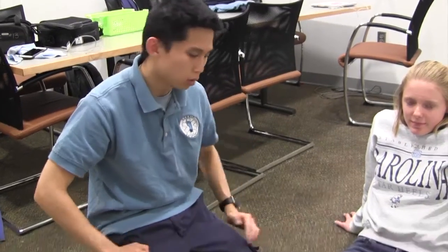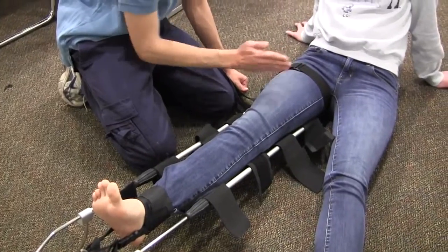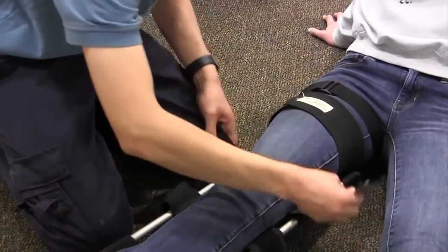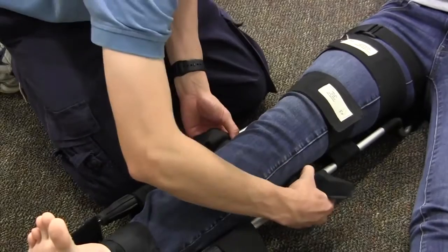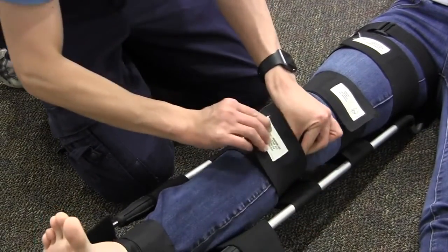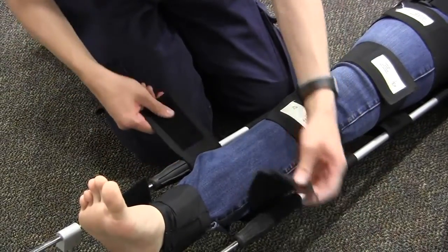Now that mechanical traction is applied, we're going to apply the support straps, making sure to avoid the fracture itself and the knee. The fracture is right here, so I'm going to go right above and right below it with the support straps. Here's the knee, so we'll adjust this strap below the knee, and this one goes right above the ankle.